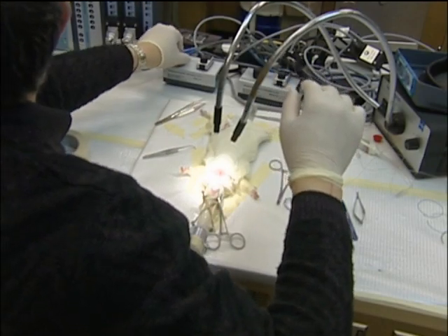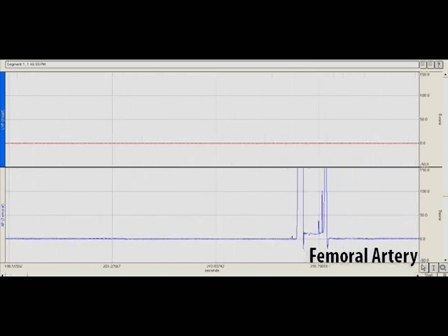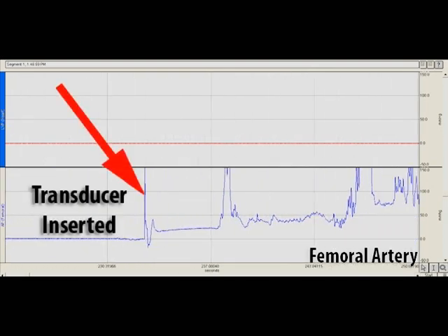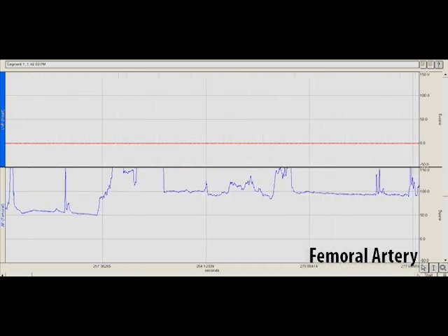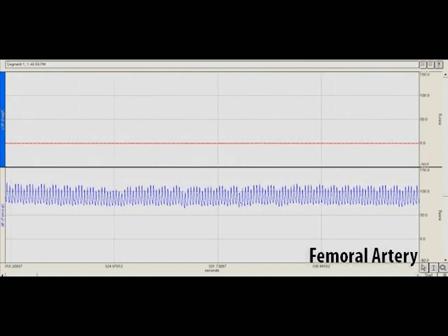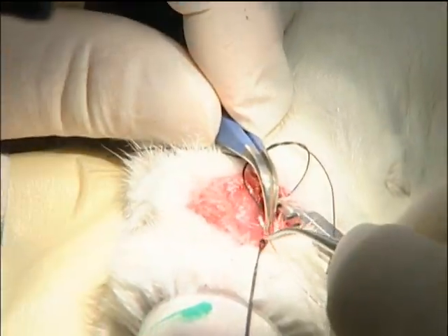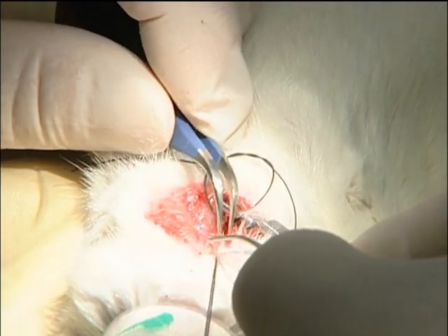and the recording device adjusted for amplitude. This will indicate pressure in the lower limb. Similarly, the carotid artery is cannulated and the transducer pushed into the left ventricle. This will measure pressure in the upper part of the body.